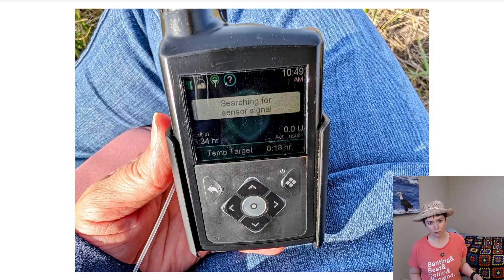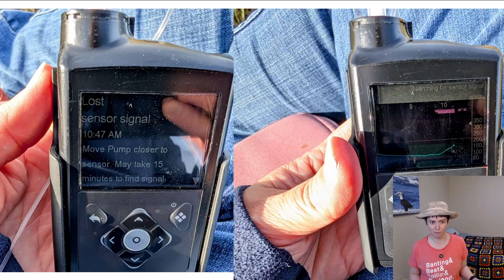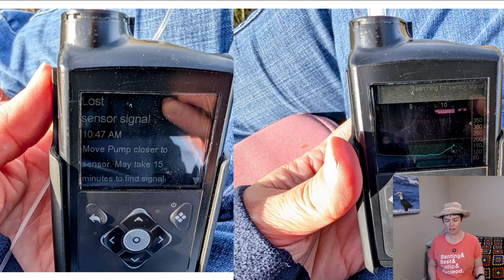You might also see 'searching for sensor signal.' You might see 'lost sensor signal,' which says move pump closer to sensor — it might take 15 minutes to find the signal. And then when you look at the graph, it might be that there's nothing, no information on that graph.